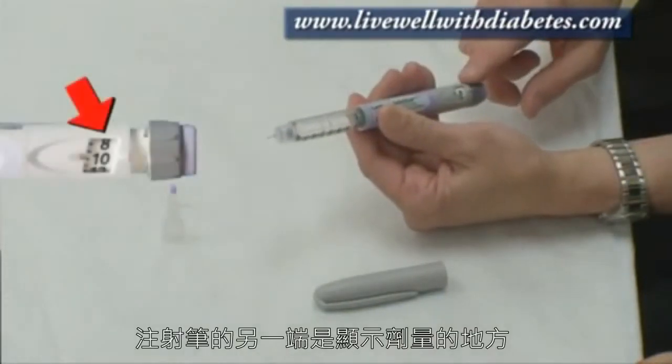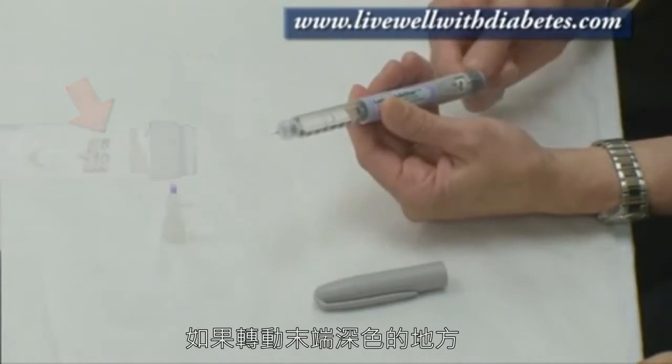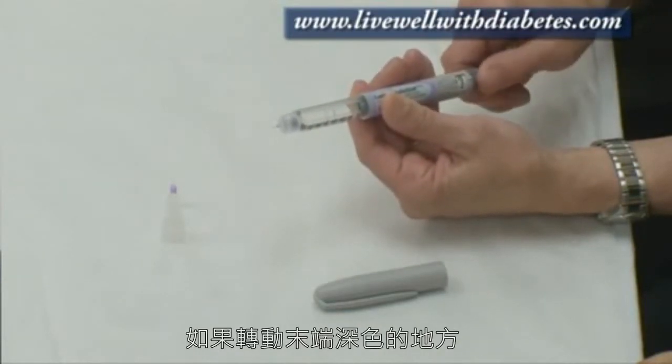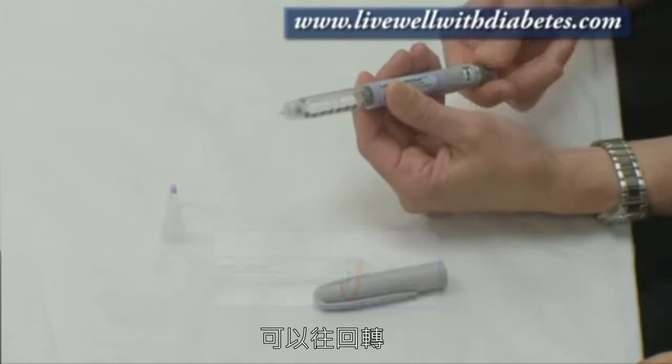On this other end is the dose indicator window, and on this dark grey end, if I turn it, I can turn the dose up. And if I make a mistake, I can go backwards.